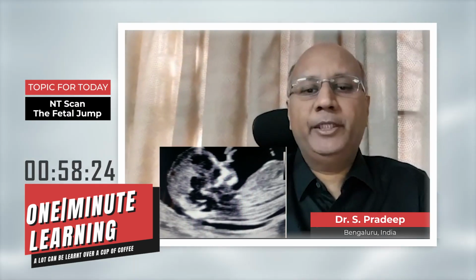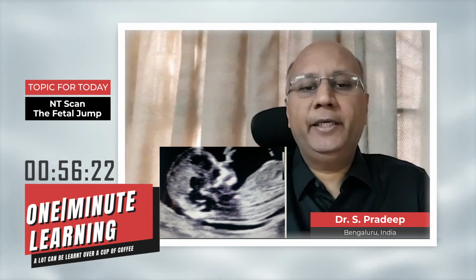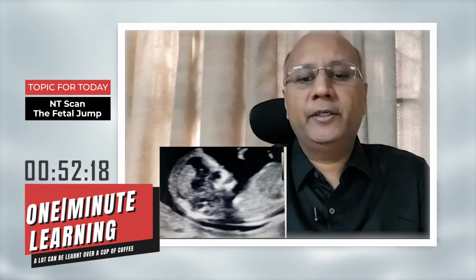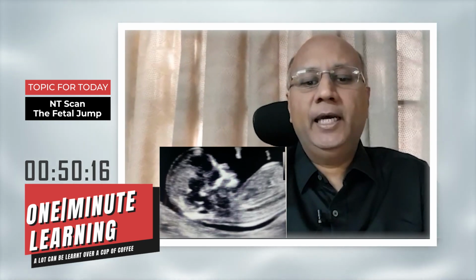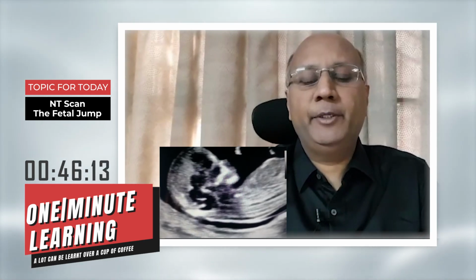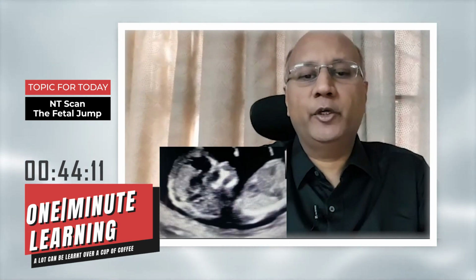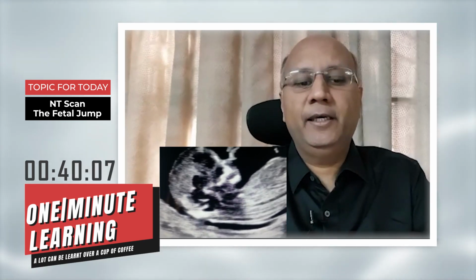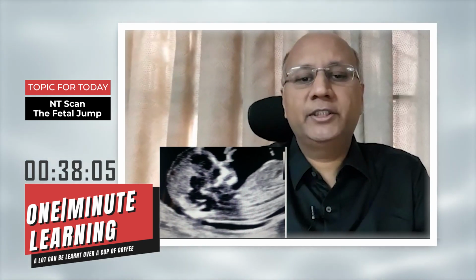This is an apt picture for measuring the NT in the mid-sagittal plane. One may wrongly measure this distance as the NT, which is actually the space behind the amnion and in between the amnion and chorion. So in order to avoid the wrong measurement of this as an NT, what we have to do is watch the cine.